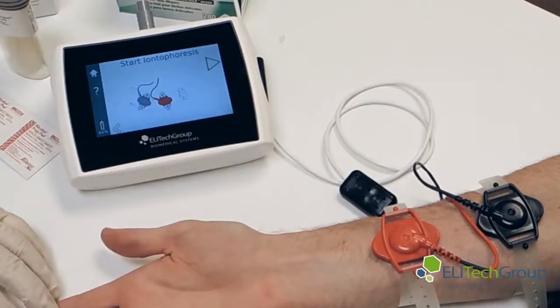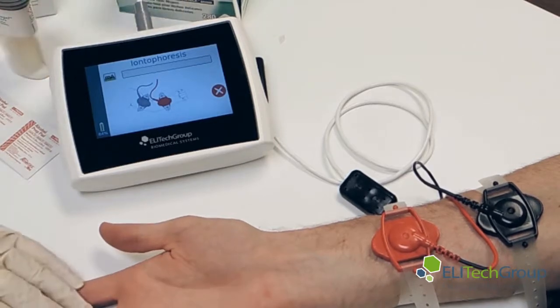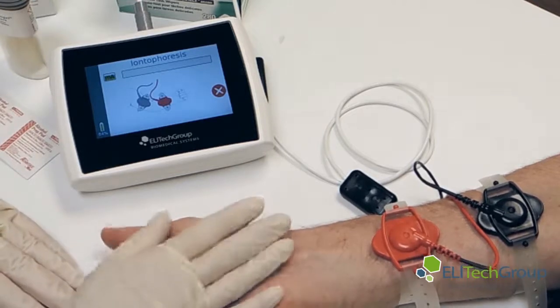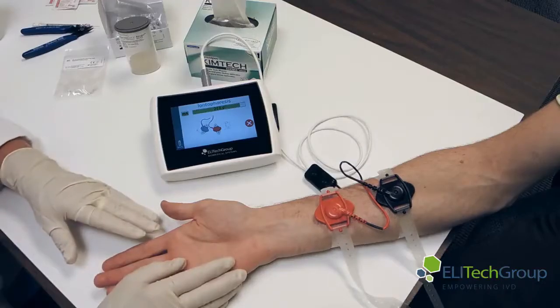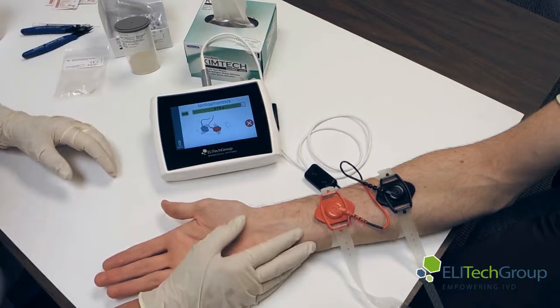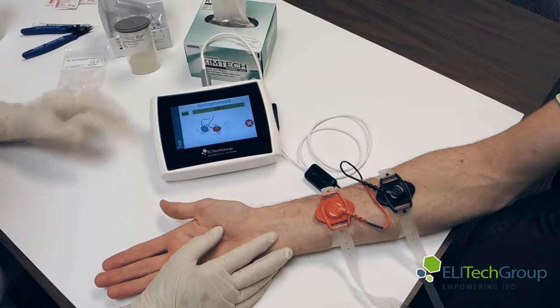Now we start the iontophoresis. It's going to take us through five minutes of iontophoresis at 1.5 milliamps as it goes through. Starting the iontophoresis — your patient should be kept quiet. It's going to run the full contact time. This will go on for five minutes. As we approach the end of the iontophoresis, we're going to prepare and get things ready to remove the electrodes. We'll remove the black one first, and remember where the red one is so that we know where to put the collection device.